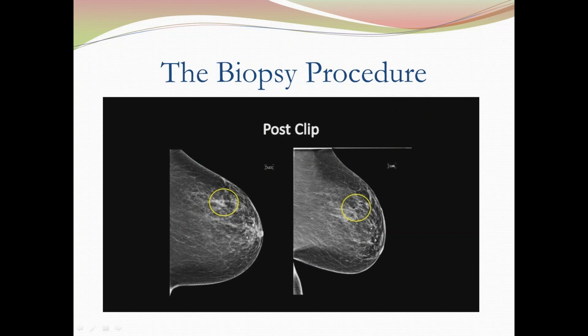So the first question is, how long does the procedure take? And that video that I showed you was pretty much real time. It takes me about between 13 and 16 minutes to do a case.